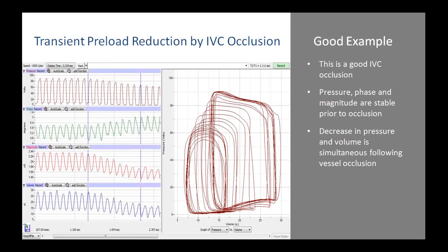Remember, this trend has to go up, since the catheter located in the LV chamber is now going closer to the muscle wall. Therefore, the phase goes up instantaneously as you're occluding. You can also imagine the chamber is emptying, blood is leaving the chamber, and the catheter gets closer to the inner walls.